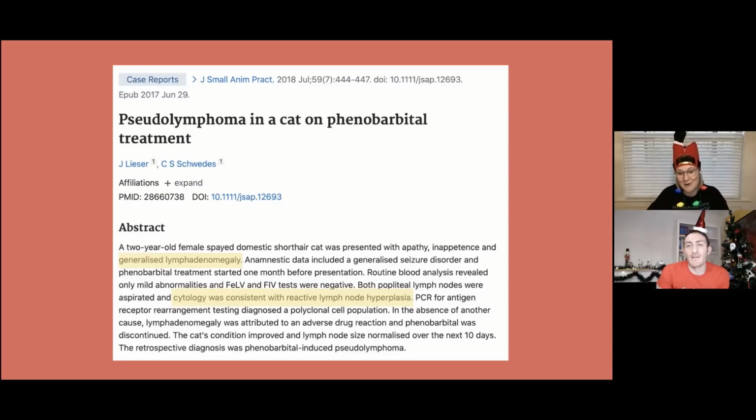But yeah, so I don't know. I'd love to actually follow up with them because this has been several years now. At this point, unless the cat's still on phenobarb, I imagine they have some kind of follow-up that might support or refute my suspicion. But I wanted to highlight this case because, even though the cytology is not all that exciting, it's a case for clinicians, or anybody really, to remember that this can happen. This is a differential diagnosis for cats on phenobarb.